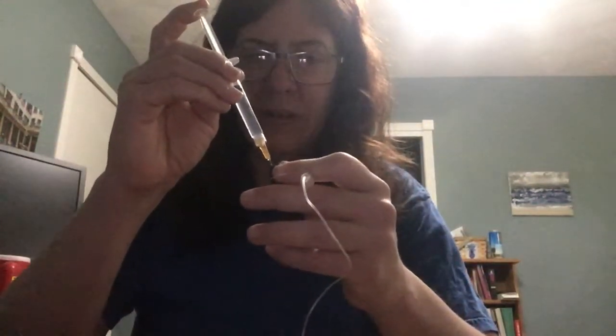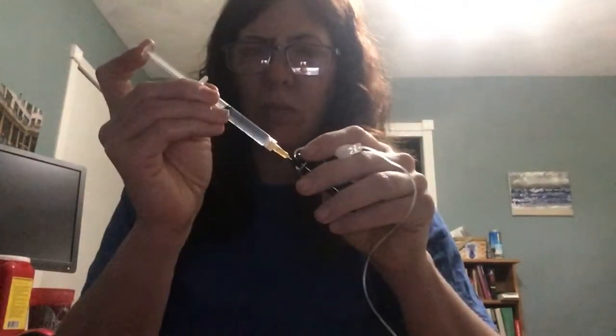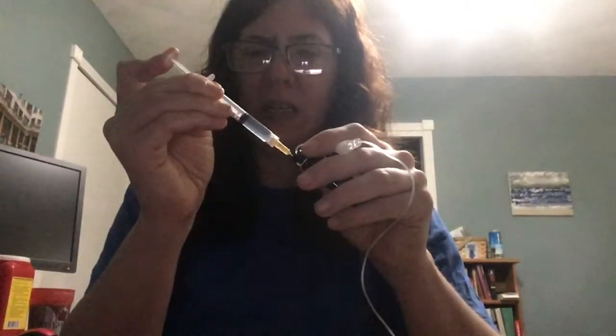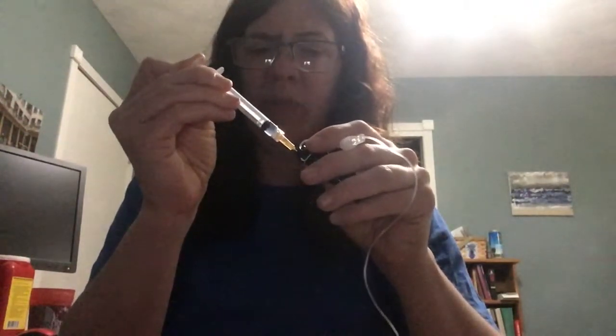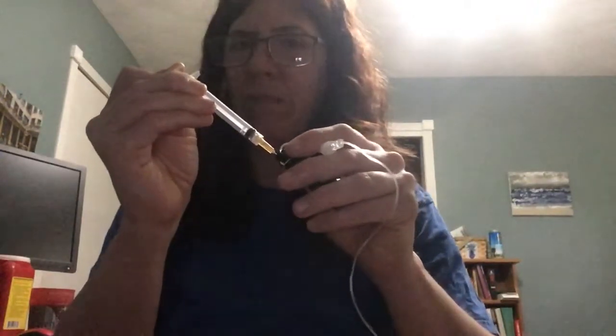And now we are going to fill this cartridge. Put the little needle bit of the syringe on that little white bit. Push it in. You'll get a little resistance, but that's fine. Now, do not remove your finger from the top of the needle. Just pop it out.